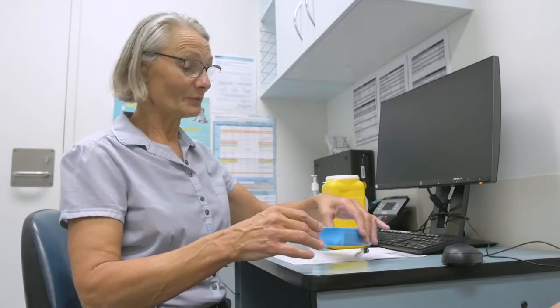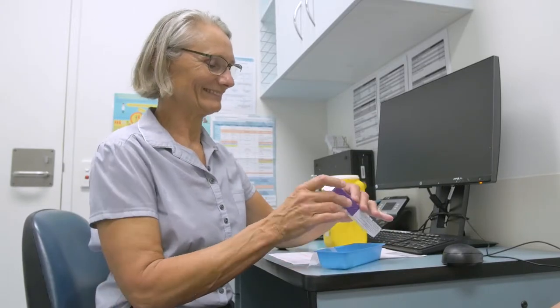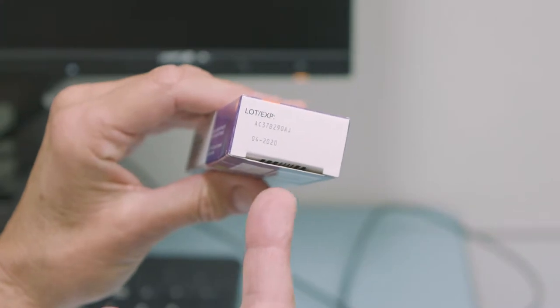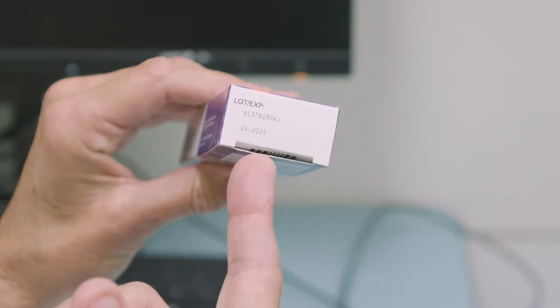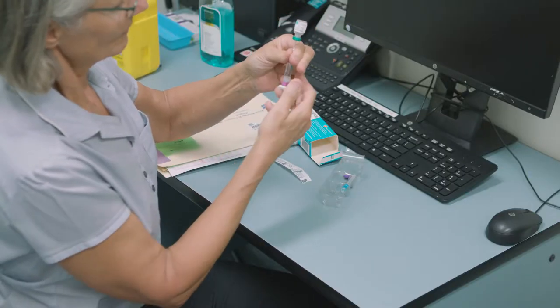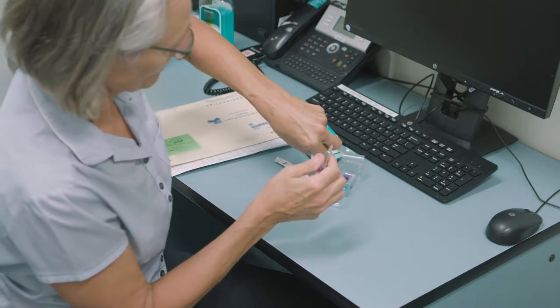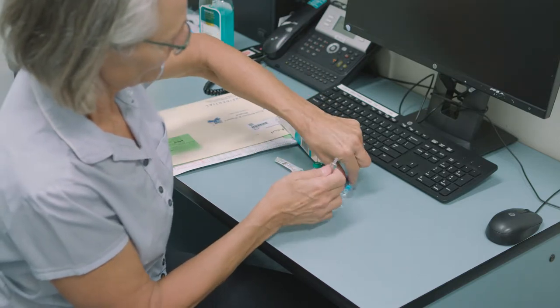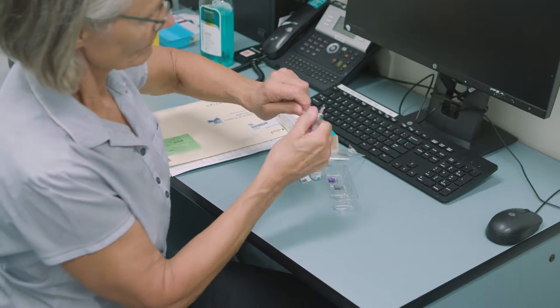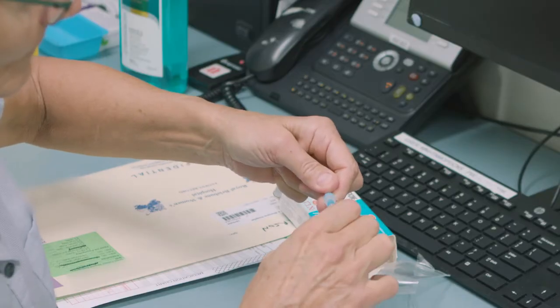When preparing vaccines, each dose must be checked to see that the expiry date hasn't lapsed. Use aseptic technique to draw up vaccines and change needles after drawing up from a vial.